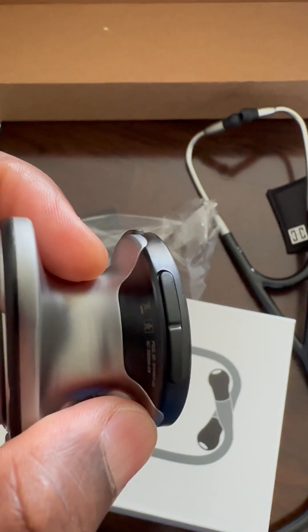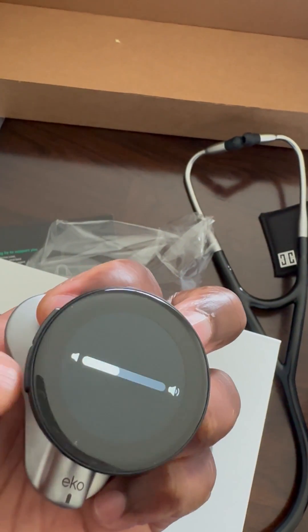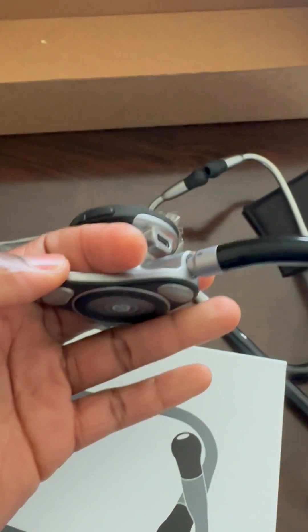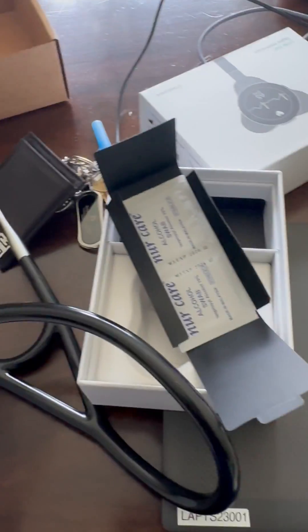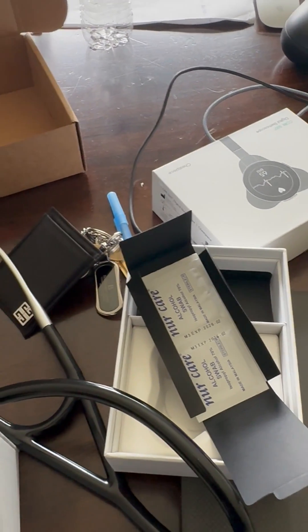The other two buttons are for volume up and down. You also have a connector here where you add the earpiece, and you connect the USB right in here for charging. That's all I have for you guys — if you have any questions just send me a message, bye!